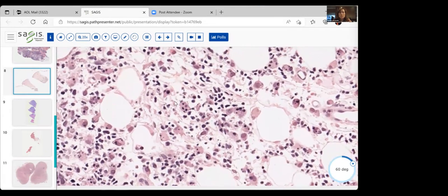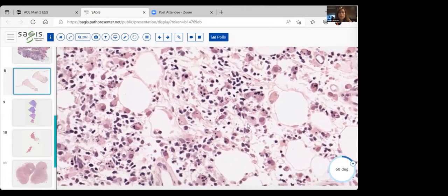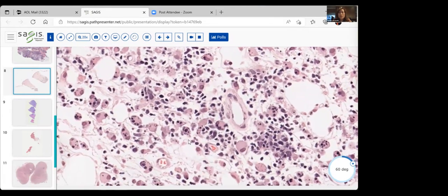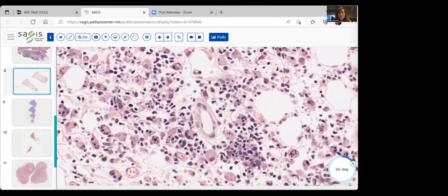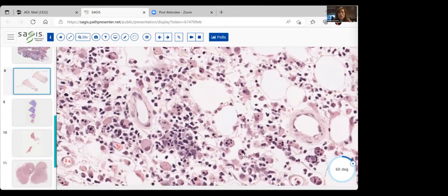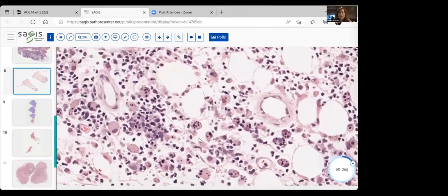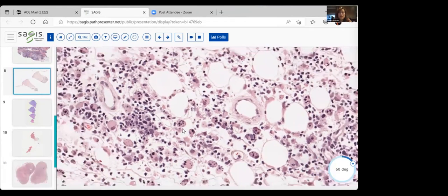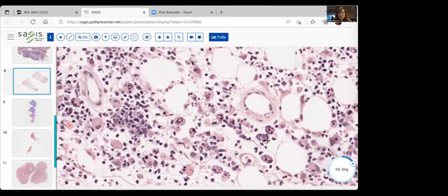Do you see cells like this? Cells like this? Let's look around and look for some more. Right down here. I think they're just fabulous. Look at this cell here. I'm going to go ahead and shine on this cell here. There are so many. Honestly, this is just a fantastic example. Is this as high as I can go? That's as high as I can go. Look here, here, here, here.